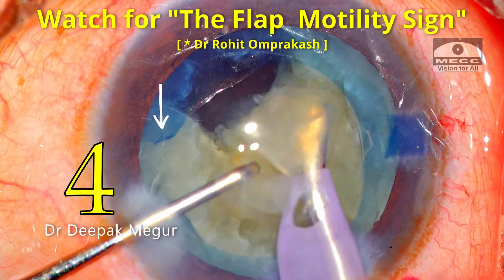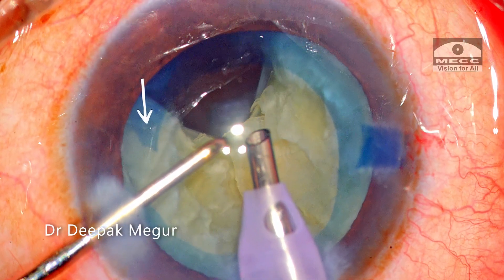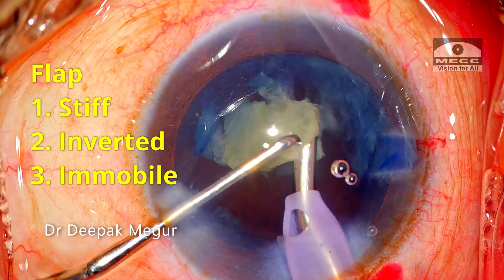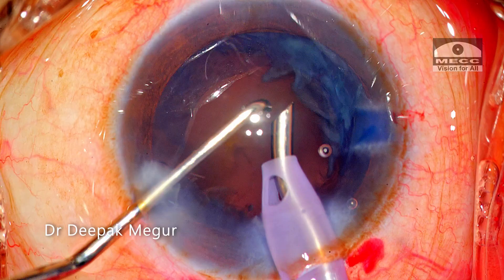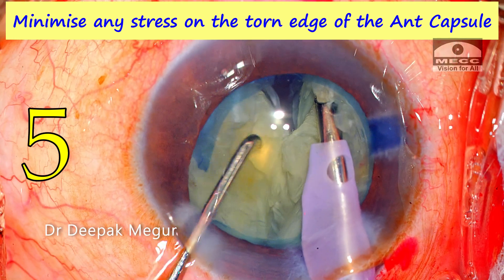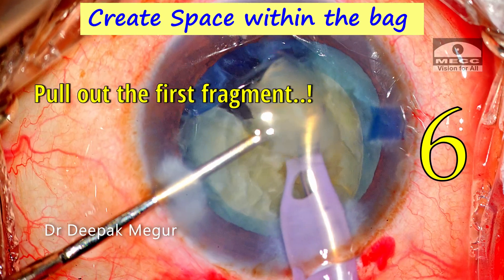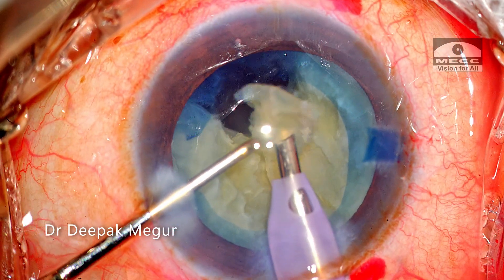Fourth, while performing phaco emulsification, I keep a close watch on the torn flap at every moment of the surgery. If the flap is mobile, fluttering, and everted, it's all good — this is the flap motility sign. However, if the flap is stiff, inverted, and not moving at all, that is not a good sign; it indicates the tear has extended beyond the equator into the posterior capsule. Fifth, during nucleus chopping maneuvers, lateral separation must be very gentle to minimize stress on the torn edge of the anterior capsule. Sixth, after the first chop and first fragment is created, I invariably pull it out of the bag and emulsify it first, which creates space within the bag and ensures lesser stress on the weak capsular margin.